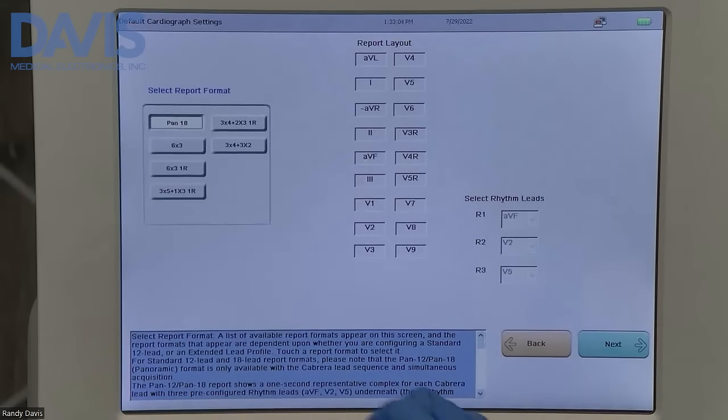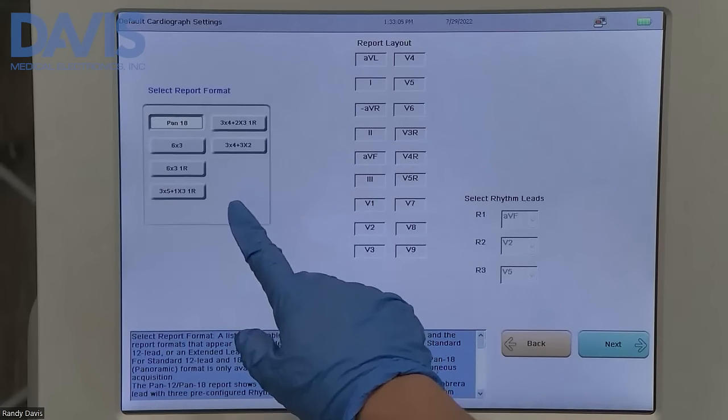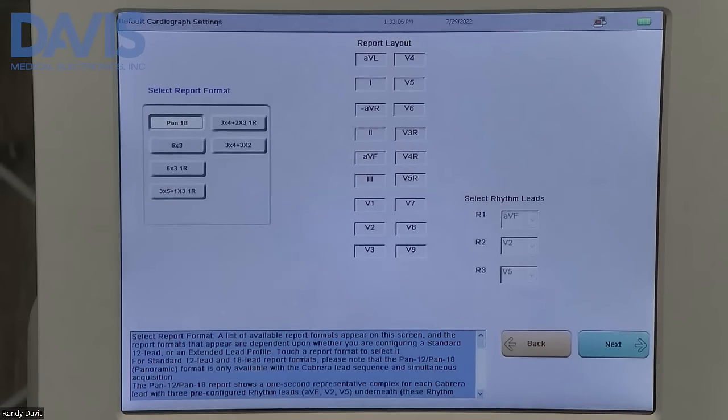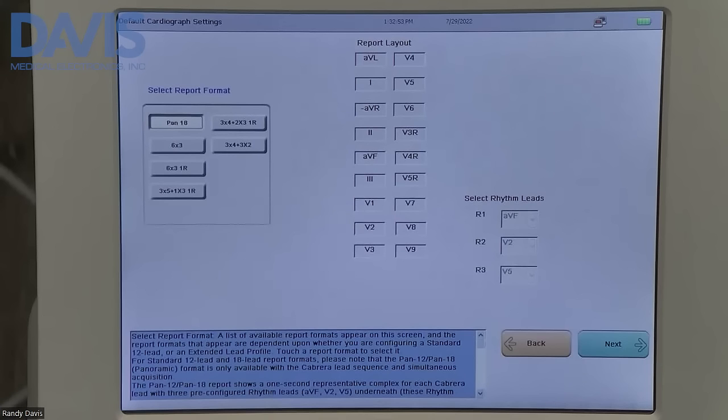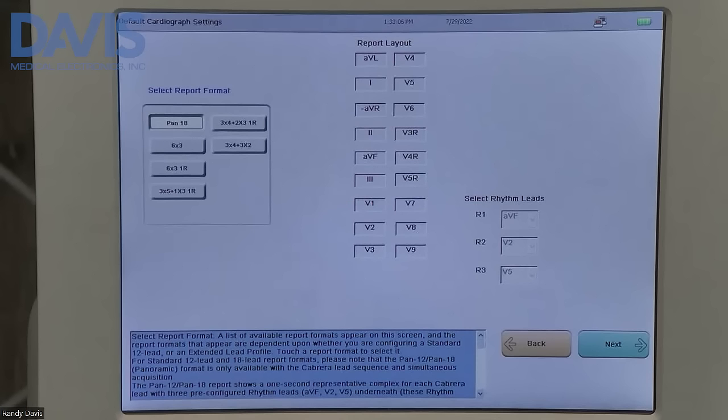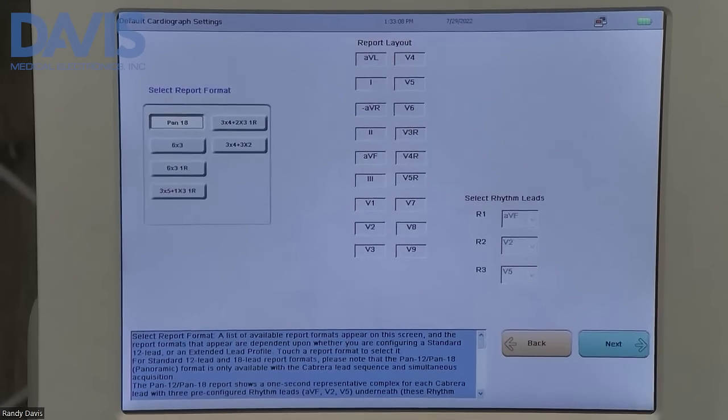From this window, you're going to select your report format. Here I selected all 18 leads on one page. Then click next.